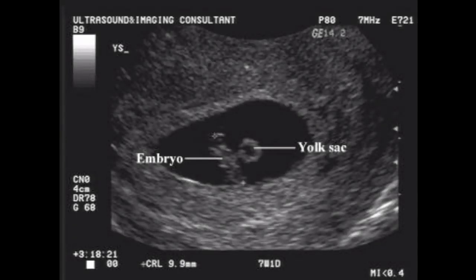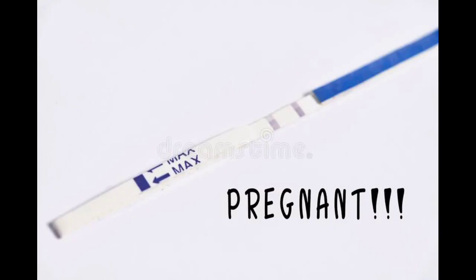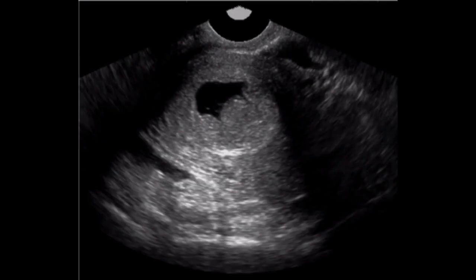Ultrasonography is a commonly used tool to evaluate the status of pregnancy. Complications arising from pregnancy are frequently encountered complaints in emergency departments and prenatal clinics. Though home pregnancy tests are increasingly popular, some women may discover they are pregnant for the first time in the outpatient setting. A true gestational sac can be distinguished from a pseudo-gestational sac by noting these points.